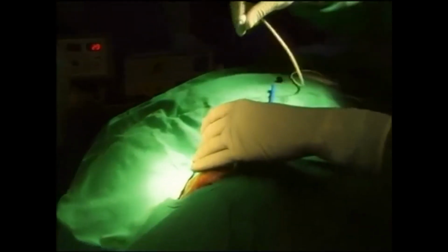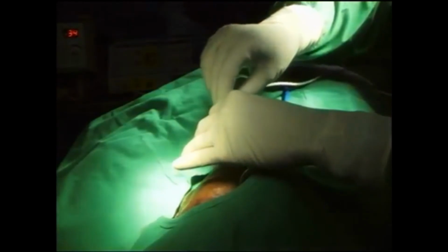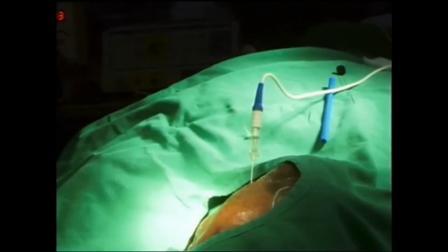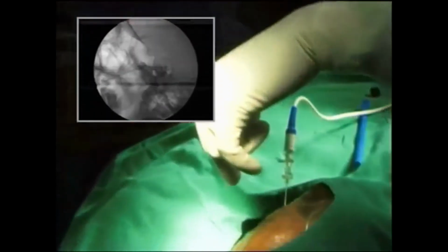Okay, now we'll do the stimulation. Sensory, motor stimulation, motor. So doing motor stimulation now. If the camera can come towards the head end and focus here, this side.